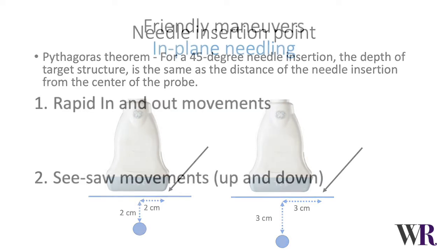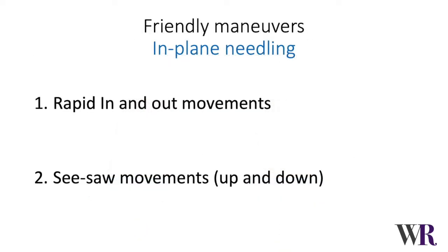Let's now have a look at two maneuvers that can help to identify the needle tip while performing an in-plane needling. This includes the rapid in and out movements, which helps move the tissue around the needle tip, and the seesaw or up and down movements. Let's have a look at them.